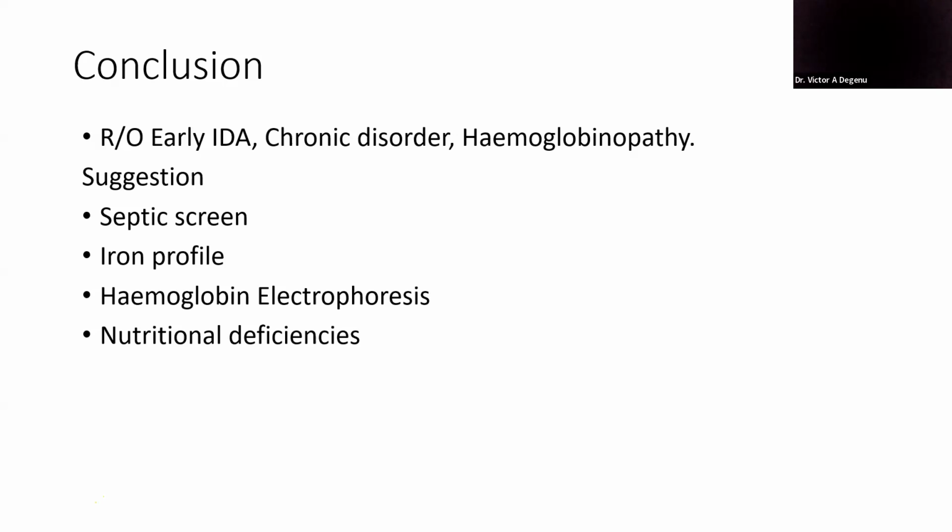So if you have any disease that is persistent for long, you may have these blood pictures. Then again, if you have hemoglobinopathy, you may have these pictures. So the suggestion is that you do your septic screen, that is to screen the patient for any infection or infectious disease.